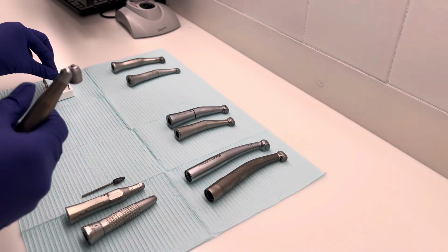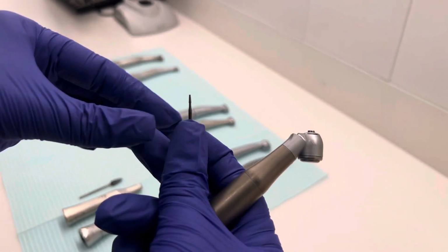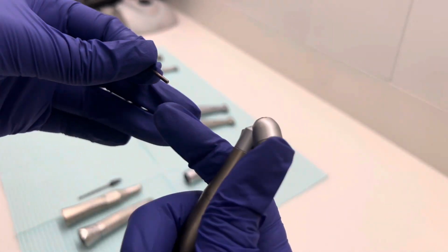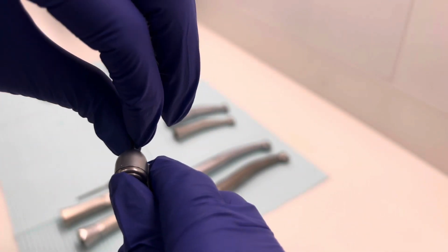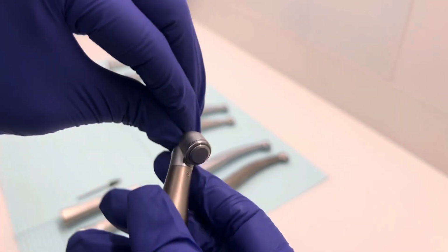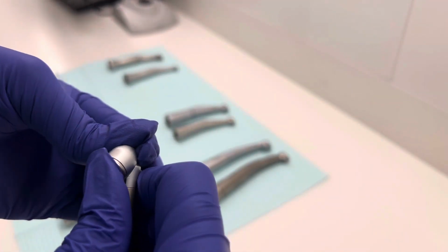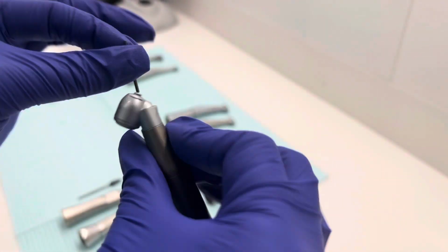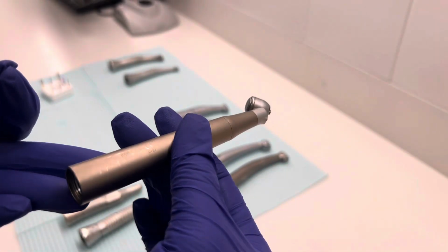So I'm using a surgical burr and I'm going to place it in this surgical handpiece. It is basically the same thing. Push the back and put the burr in the handpiece. Make sure it's secured and does not come out at all as the operator is using it. Same thing to take it out. You just push the back and slide it out just like that. And that's basically how you use it. It's as simple as that.